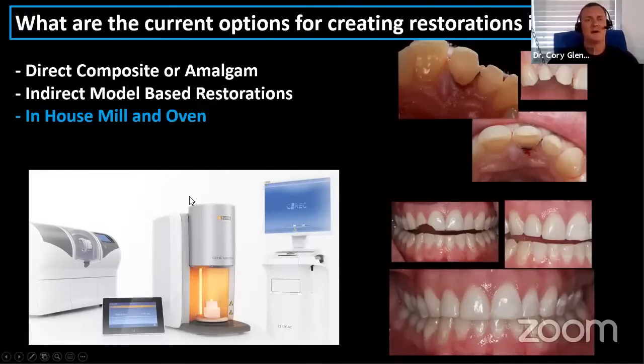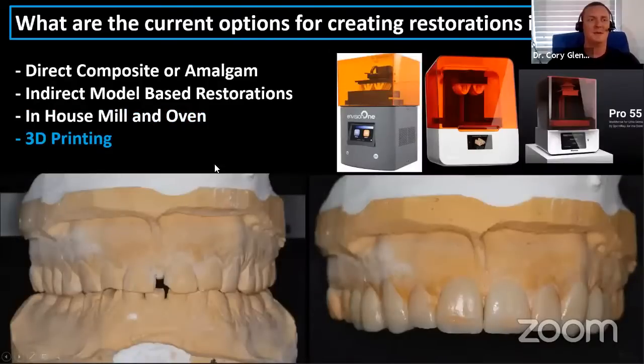So Cerec is great. I still think it's the fastest option out there for same day dentistry. You know, these other options I'm talking about, like the Axis Mill, you are going to have to piece together multiple softwares, and it will inevitably lead to a little bit slower process, but it's not much slower. And so, you know, I'm hoping to be teaching a lot more of that in the very near future.